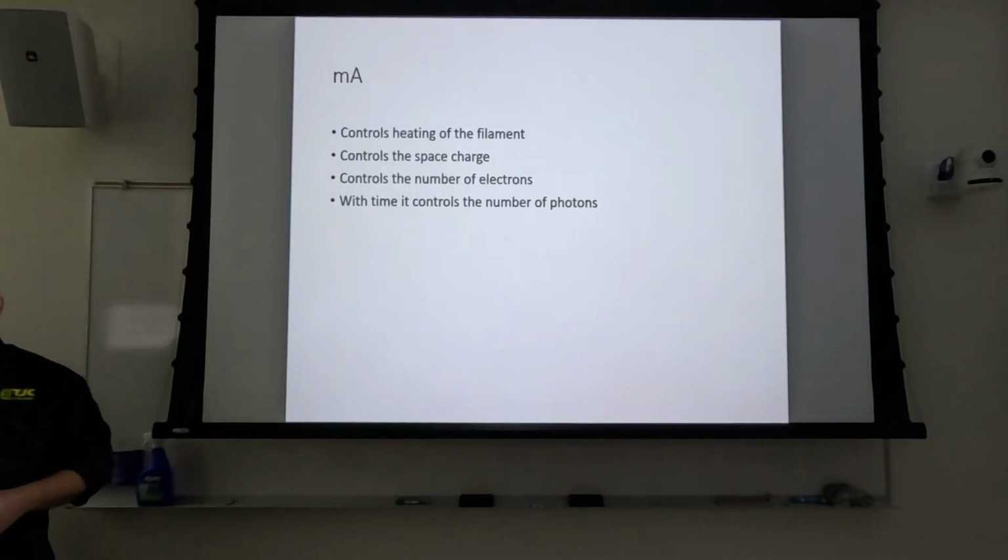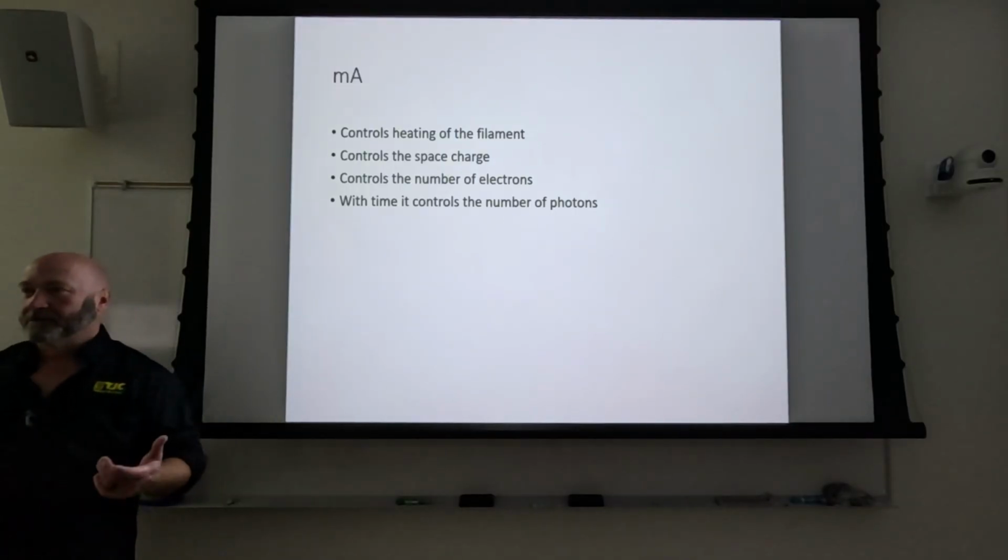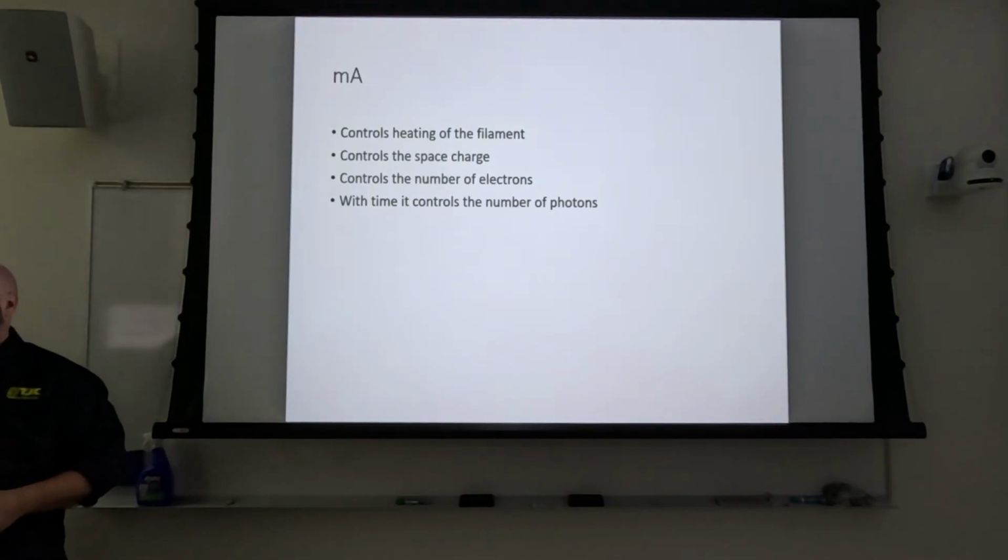So how you can test that is, let's say your tubes are exposure limited on small filament. So let's say you try to set 300 mA on small filament, it's going to give you tube overload. You can't make the exposure. But if you drop it down to 200 mA, it'll let you make the exposure. So you set 200 mA at 0.1 seconds and it allows you to.